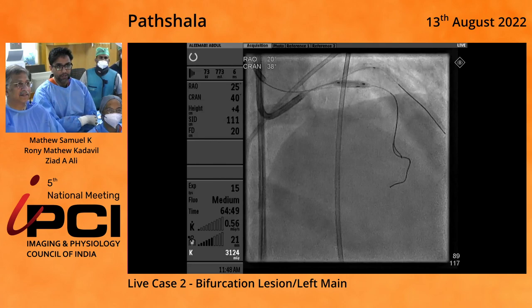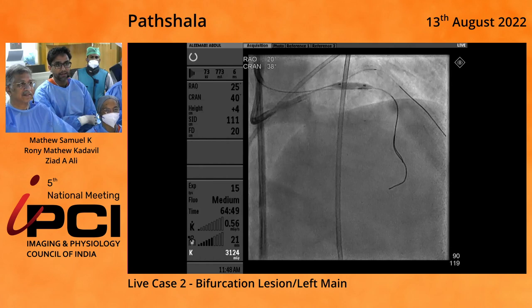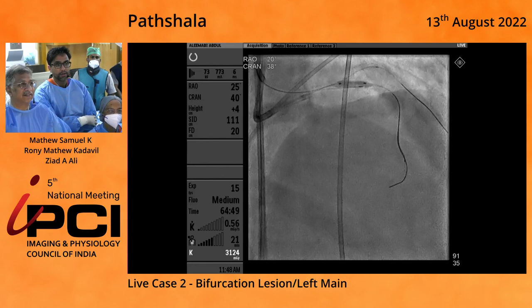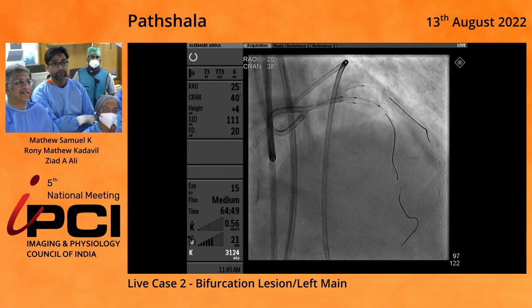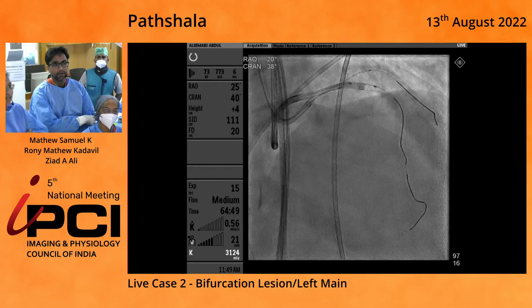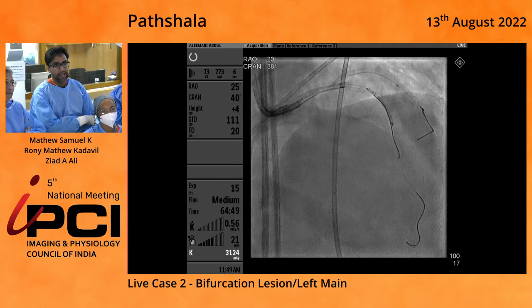We then advanced a multi-purpose 6 French longer guiding catheter inside of our shorter guiding catheter. What you'll see here is balloon inflation. And then what we do is we actually push the 6 French guide. I'm pulling back, we're inflating, and now Ronnie's going to push the 6 French multi-purpose guide into and past the stent. And then we were finally able to put our Graftmaster in.